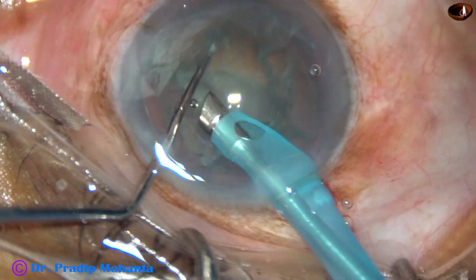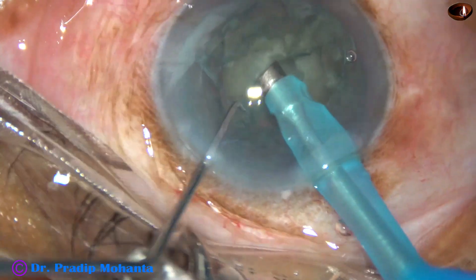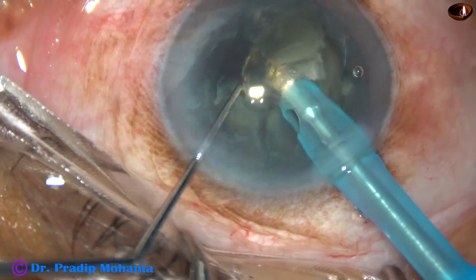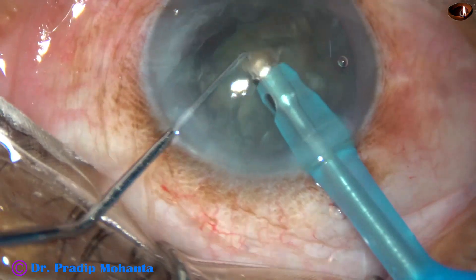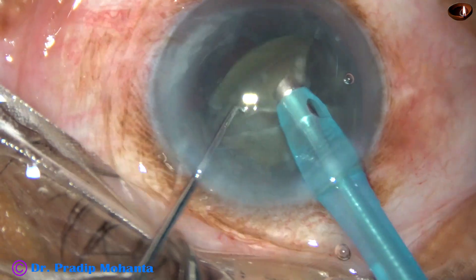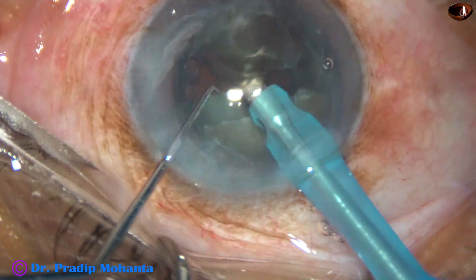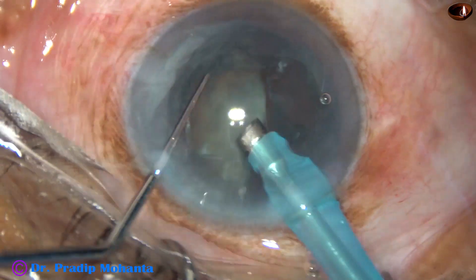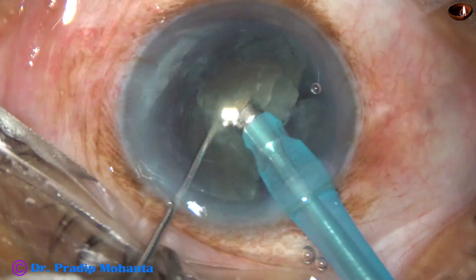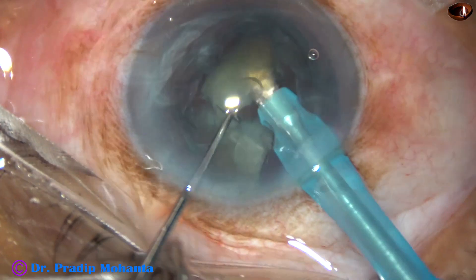There are two air bubbles — the air bubbles are removed. Now the nuclear mass is chopped again. The free nuclear fragment is emulsified and removed. Another nuclear fragment is removed. And now the remaining heavy nucleus is again divided into two parts and it is removed.